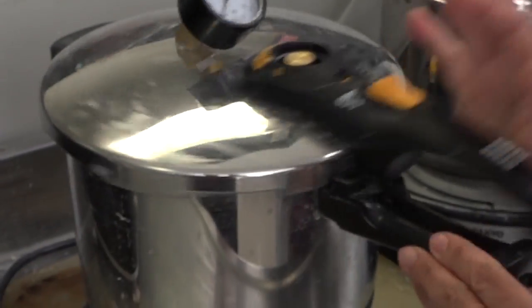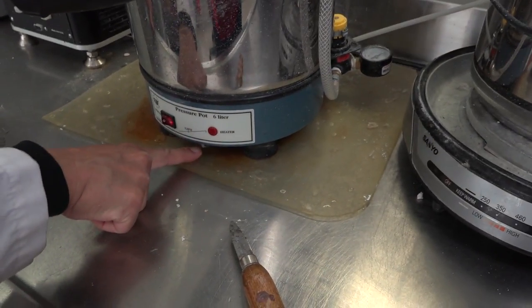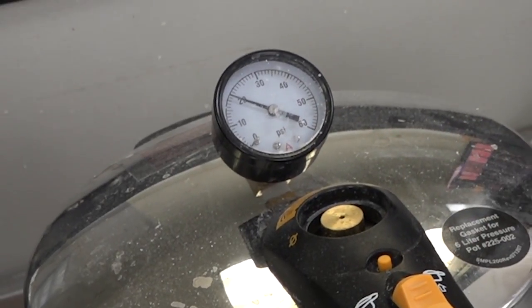Place into pressure pot set at a temperature of 120 degrees Fahrenheit, pressure set at 20 pounds per square inch. Give it 25 minutes for it to cure.